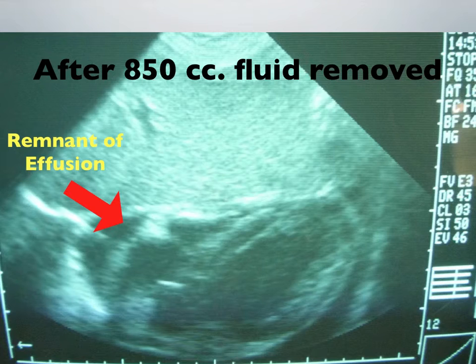And of course, in the US, we would be using sterile towels and ideally have this done in a cardiac cath lab. If it had to be done in the emergency room or in the intensive care unit, it could be performed there, and you would use as sterile technique as you possibly could.